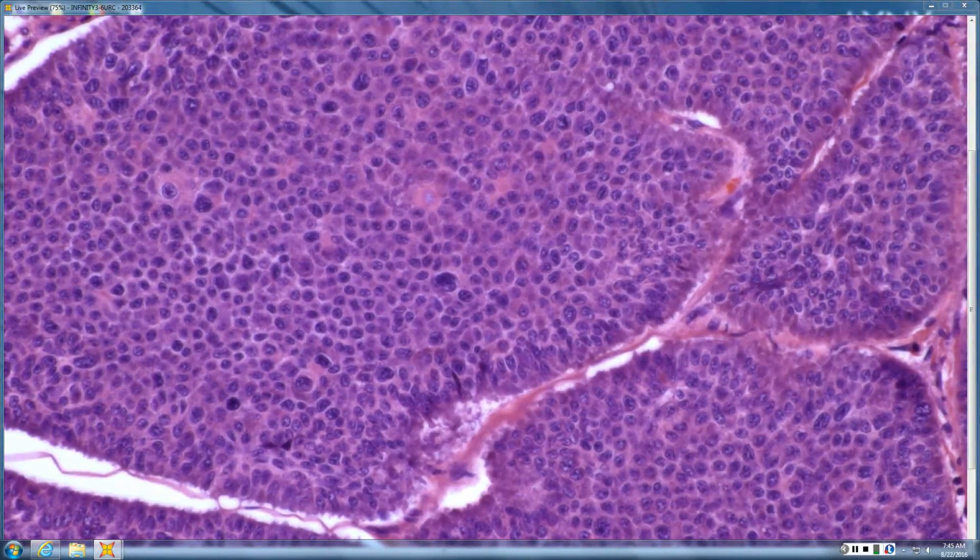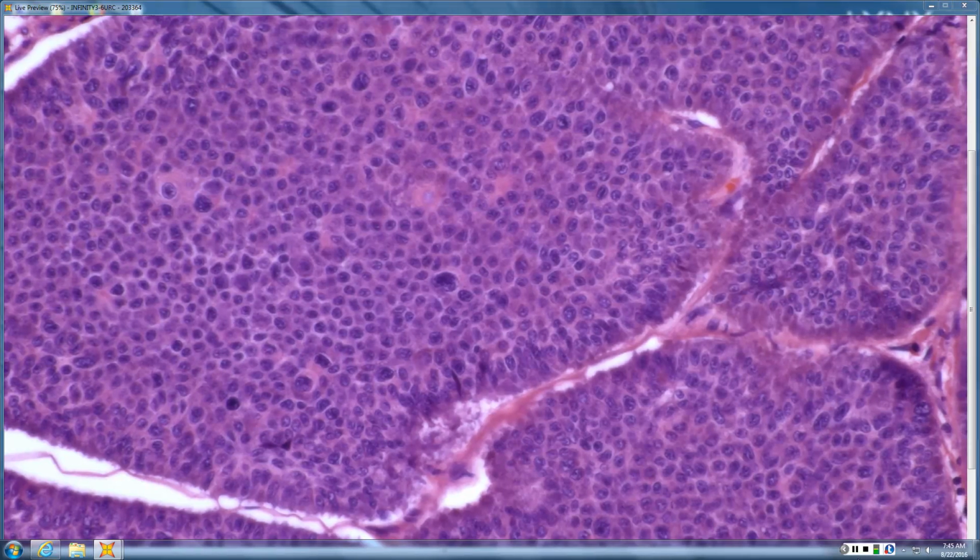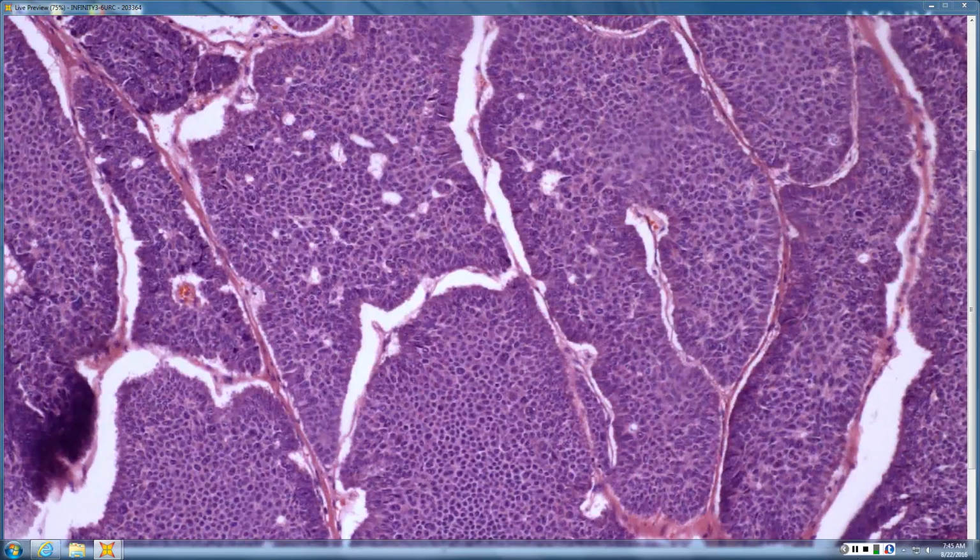Malignant poroma, malignant acrospiroma, porocarcinoma. There are about 20 names for the same tumor. Any of those names is fine. Like a lot of other malignancies in skin, the first thing that you'll notice is that it has too many nuclei. Your nuclear cytoplasmic ratio is not that of normal tissue. Here you have pleomorphism of nuclei. The nuclei are big. The ratio of nuclei to cytoplasm is too many nuclei.